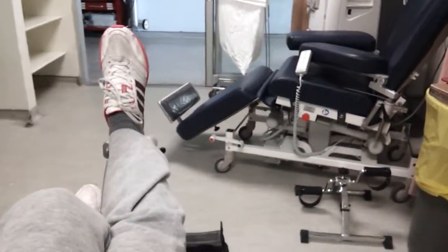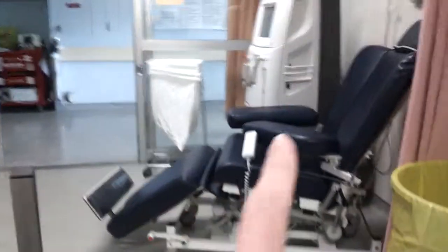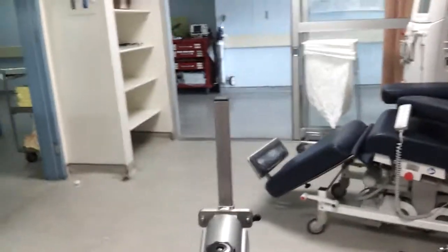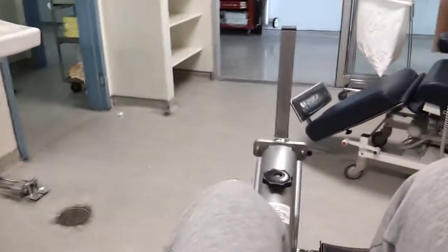So this is actually the dialysis bike. We don't actually own this bike yet. This bike is a loaner. So it looks just like that chair, but this part here is missing. And that's why I have the bike part. So you can see this bike is actually attached here, and it can be unattached and removed so that I can put the legs up just like that one. Alright, so it can be comfortable as well.